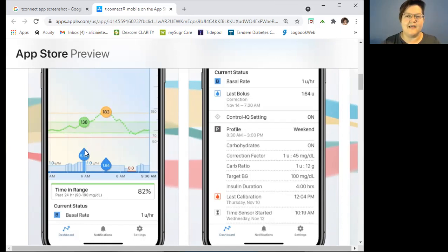And then it was also really nice to see, before I would go into a workout, if I'm going to work out right here at 6:30 a.m., or if I'm at 6 a.m., maybe right before breakfast. Oh, look at that. My blood sugar maybe wasn't even rising. Maybe I'm holding flat, but the system has been cranking up my basal to keep me there.